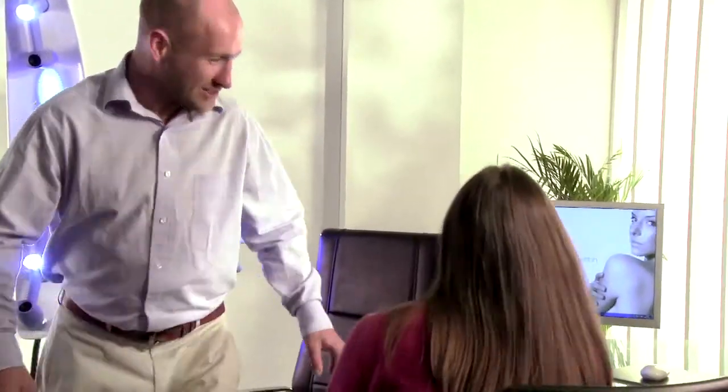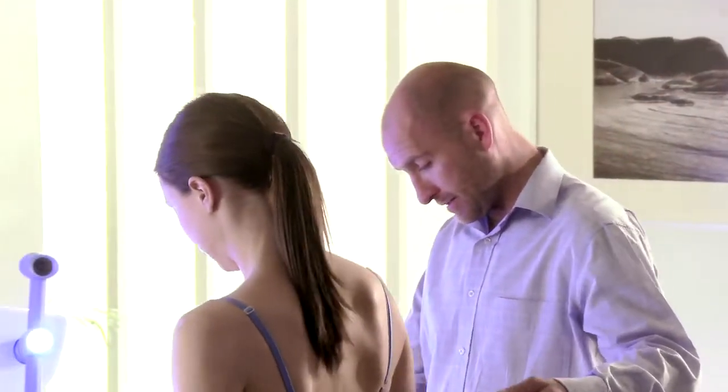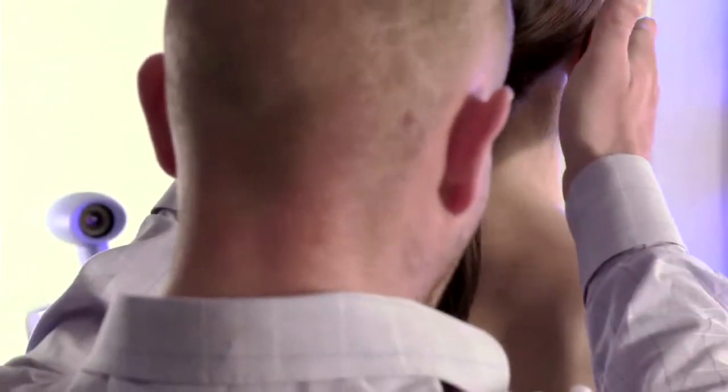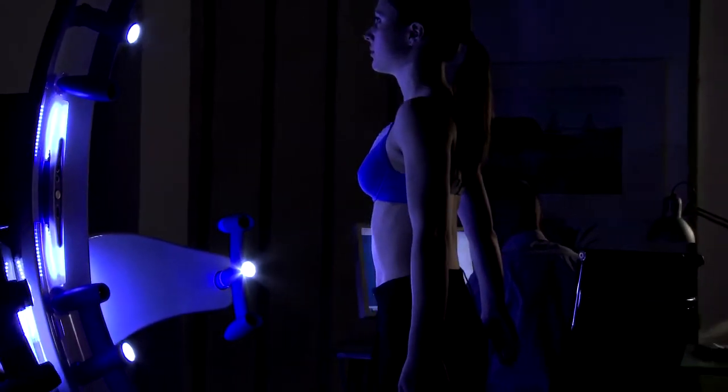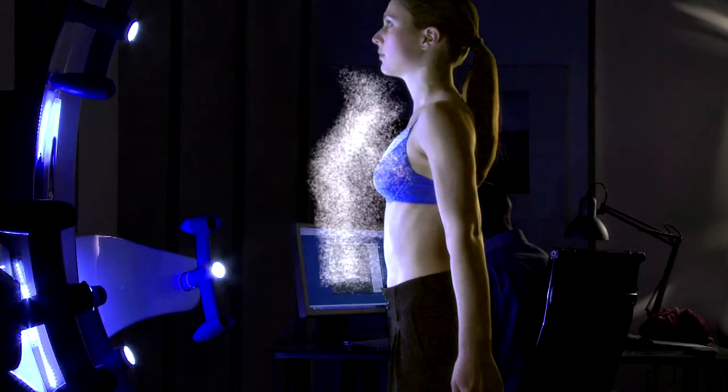With AXIS III, your patients can visualize their results before surgery and make better decisions quickly and with greater confidence. AXIS III's patented CCT, developed in conjunction with Siemens, instantly captures millions of measurements and high-resolution imagery that, when processed, creates an exact 3D digital cast of the patient's body in just seconds.